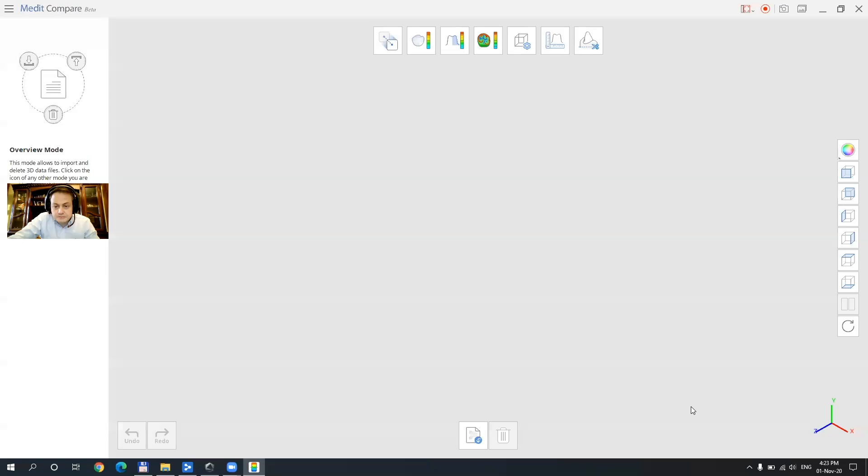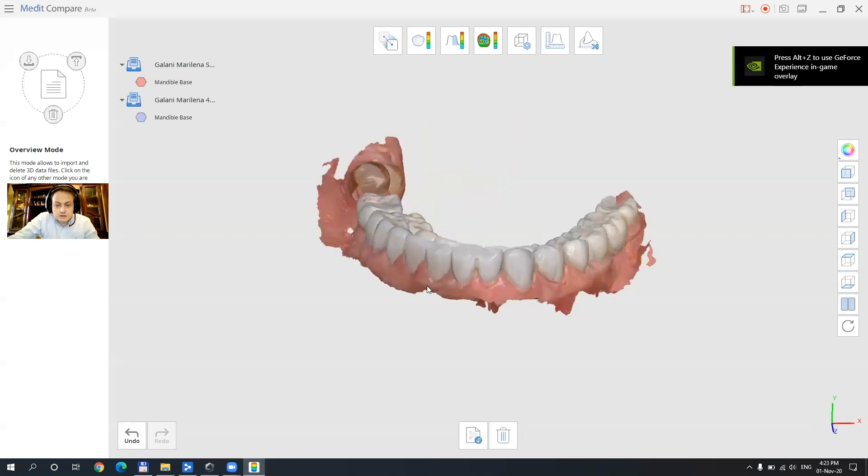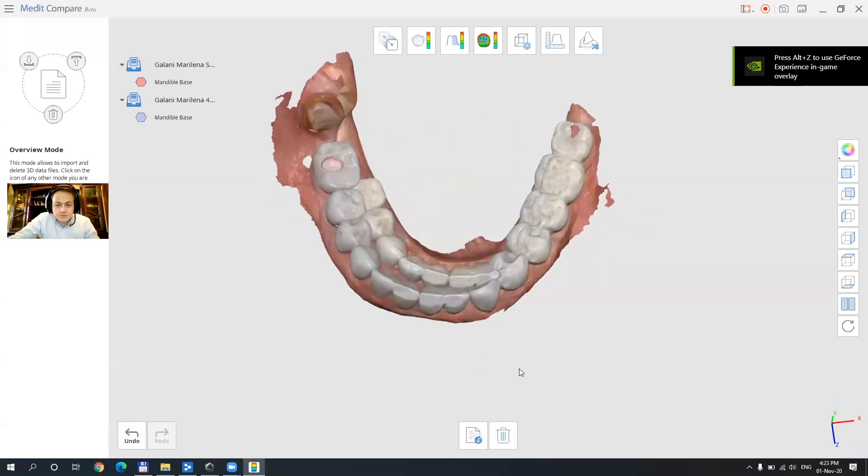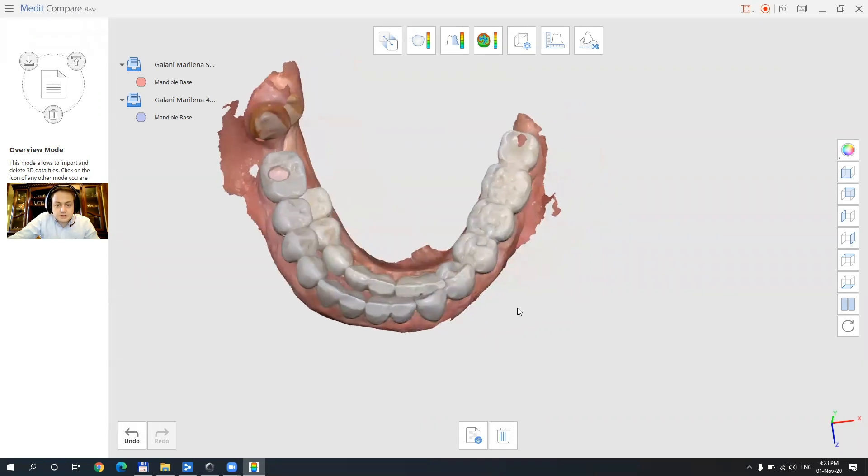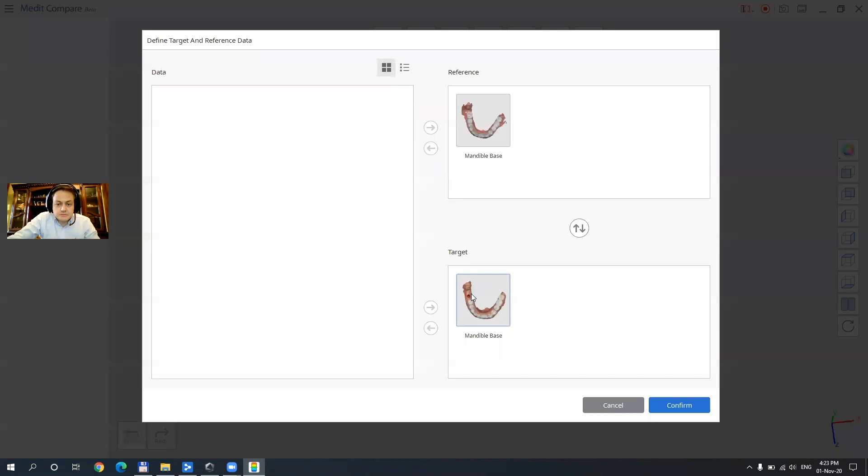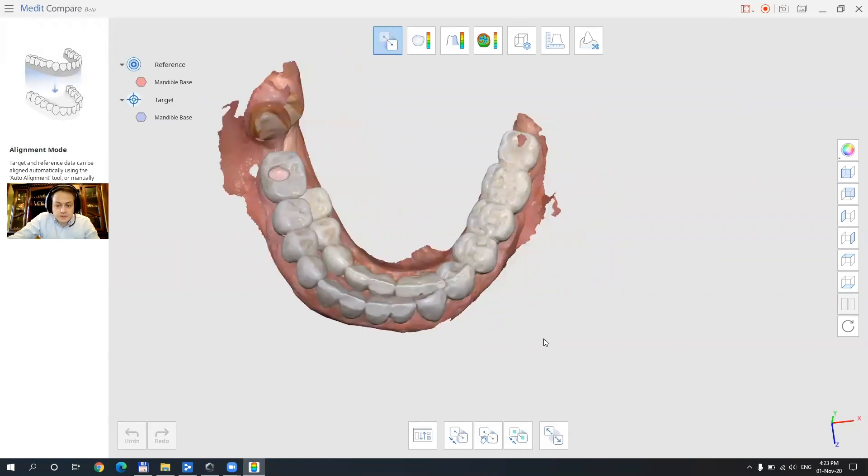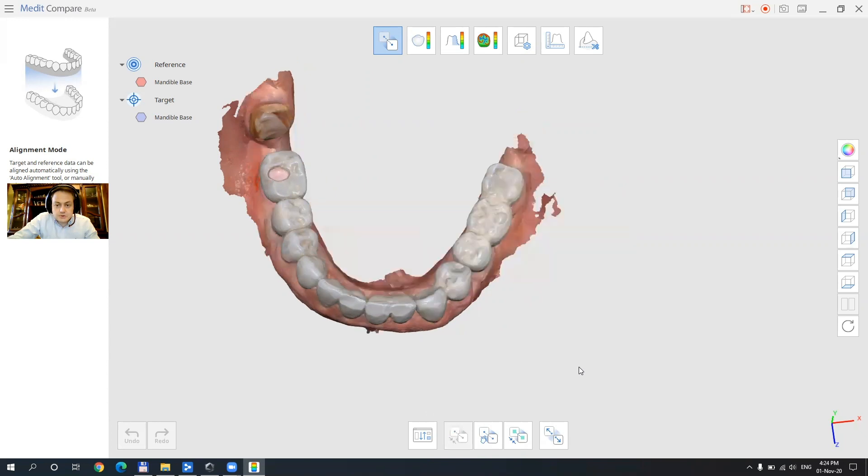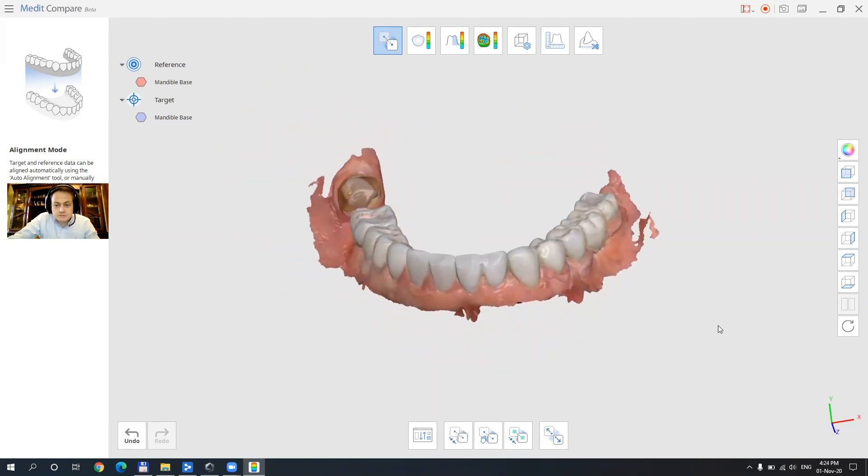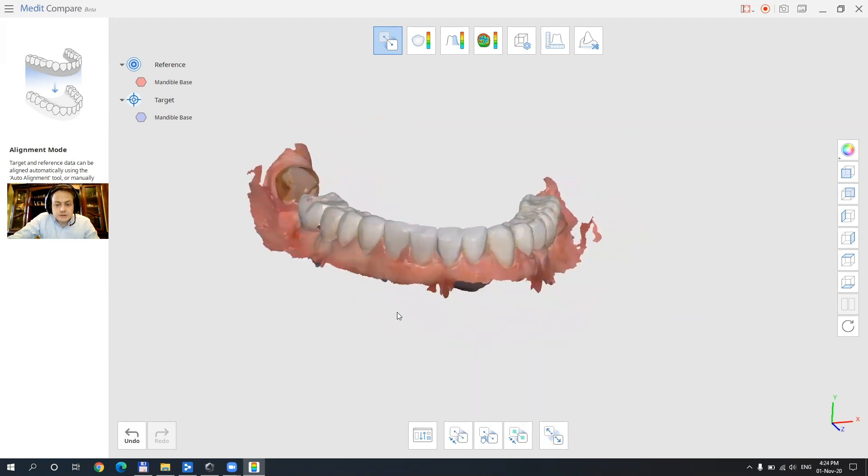Okay, let's do this. Both arches are just opened up. As you can see they are not aligned. So first thing we have to do is to set them in the correct position. This is done by choosing the alignment mode in this application. Here we will be asked which arch aligns to which and they are already selected here. Now with this function already in place we can choose to try an automatic alignment. Okay, let's hope this works and it's created. It's been aligning them perfectly.